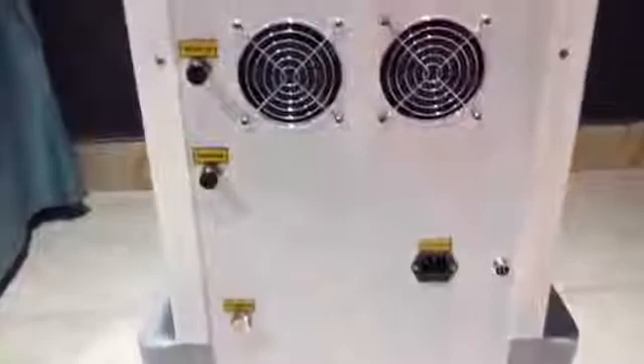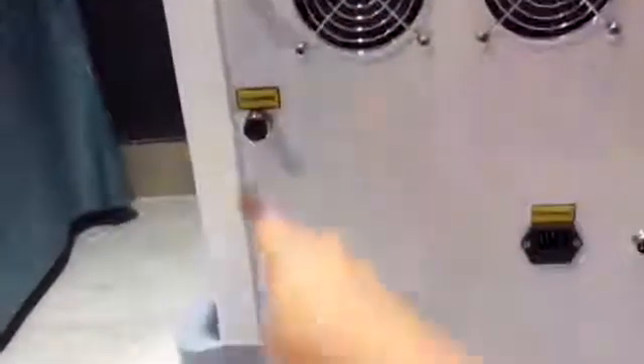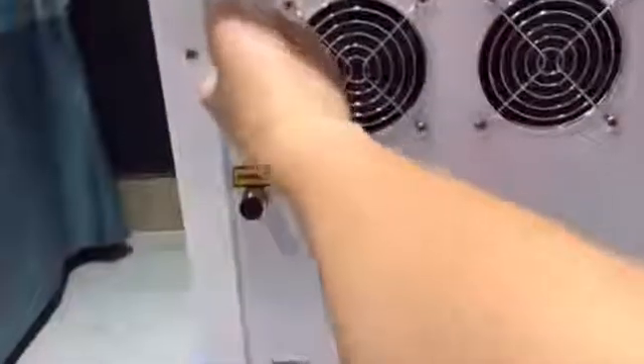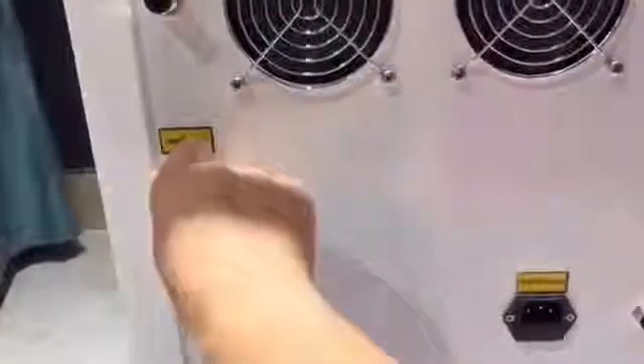After handpiece arm installation, let's fill water for the machine. There are three holes: water in, water overflow, and water out. When you receive the machine, the three holes have been covered. Open the water inlet and water overflow.